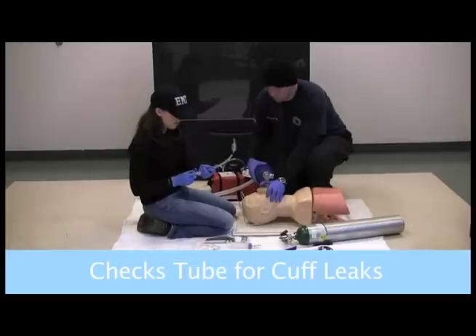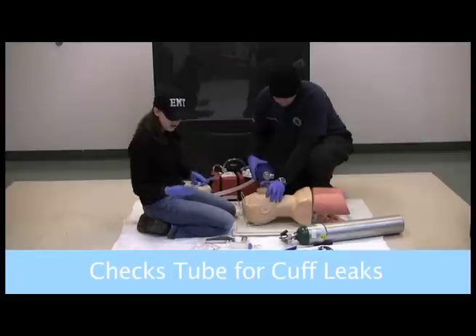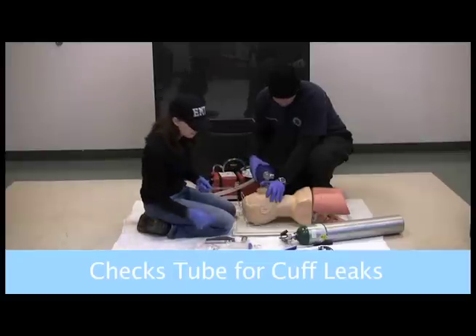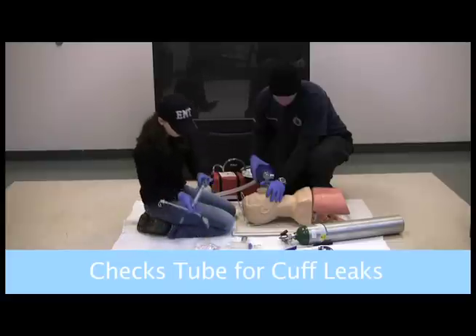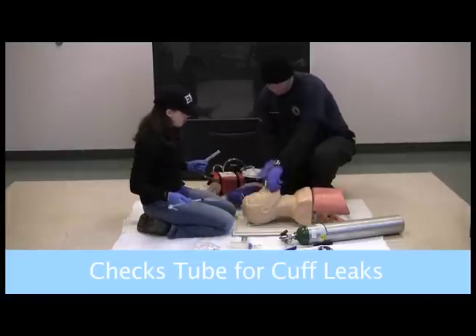I want to make sure I get all that air out, and I can go ahead and leave this open so it's ready. As soon as Tom is ready, we can go ahead and start the process.